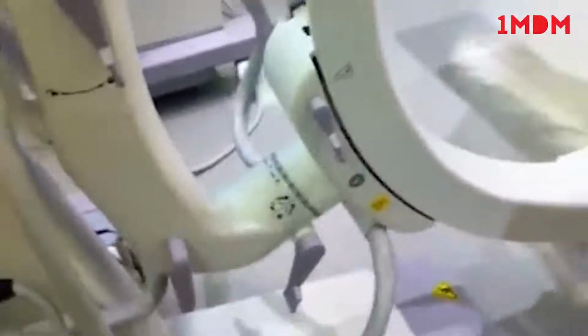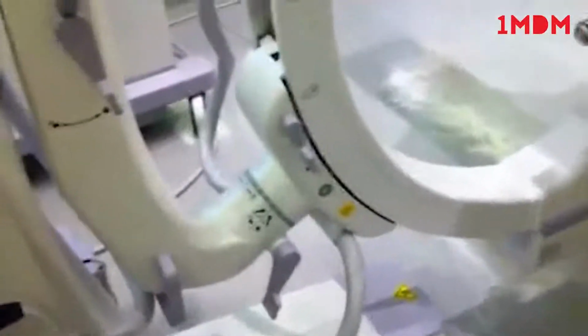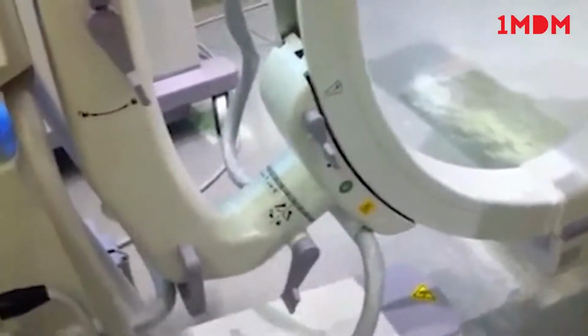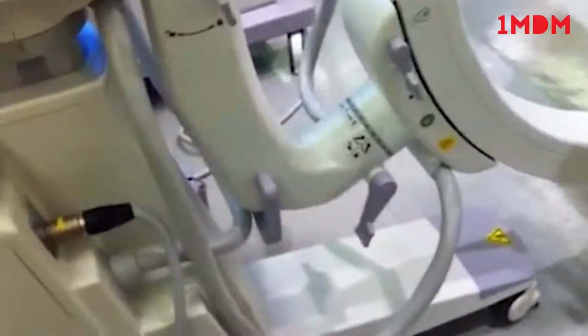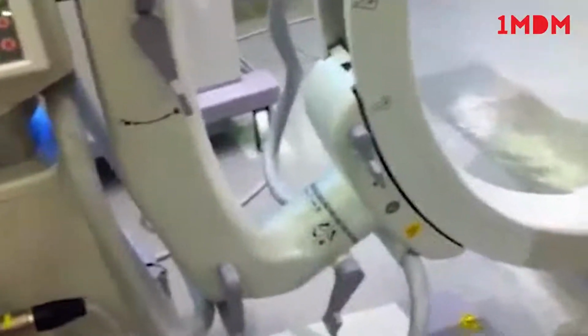It has something called the GE Smart View. Basically, this lock and this lock down here, if I unlock both of them, I can actually swing the C-arm side to side to correct wigwag without having to recenter. A unique option that not every C-arm has, but I'm not going to display it here. There's simply no time or need for that. I just want to describe the basic functions.